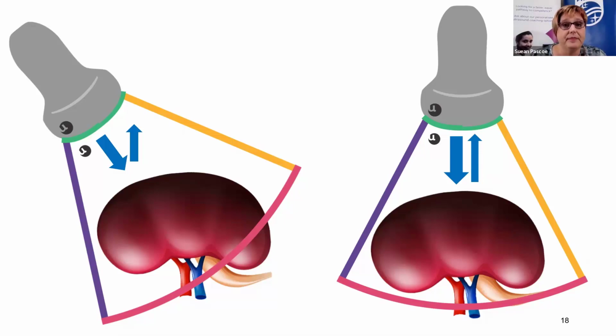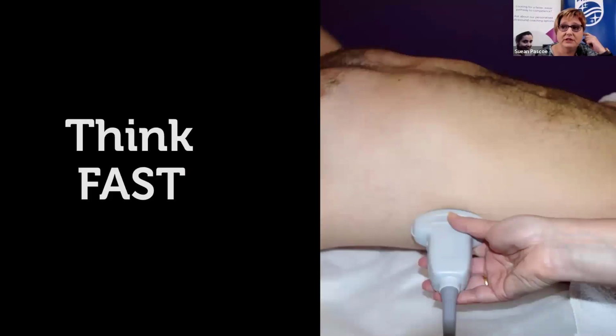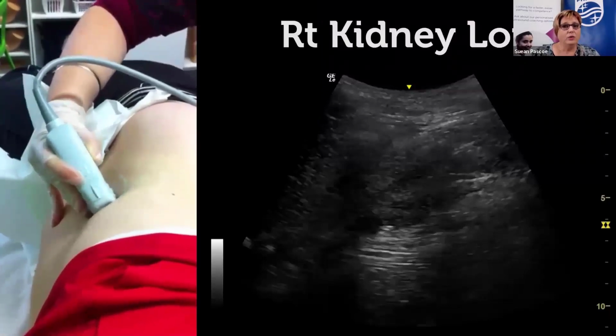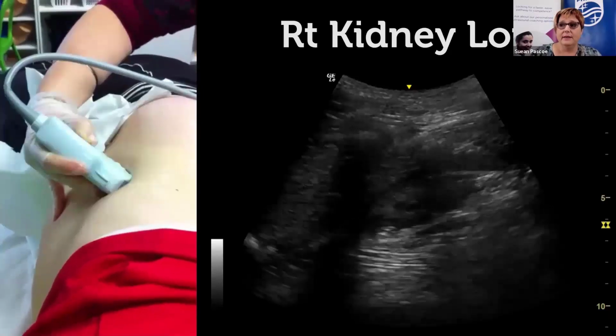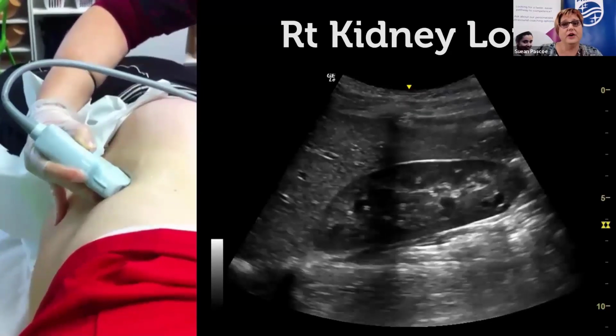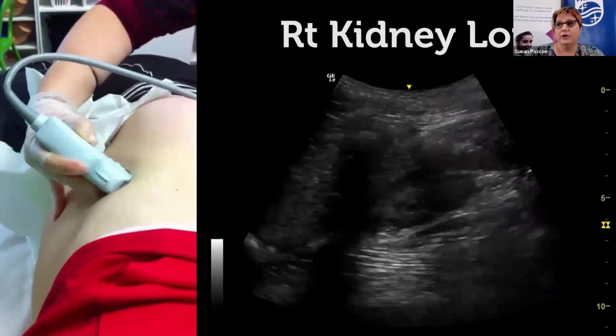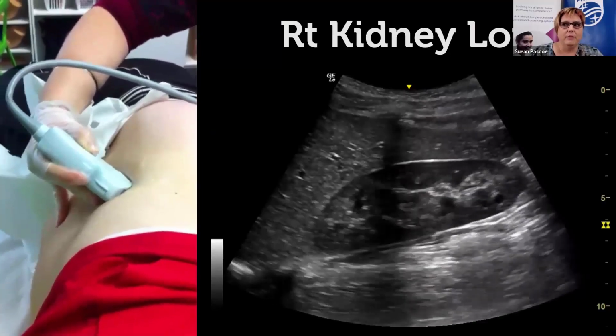Now, when your patient's in the supine position, think about the FAST exam and how you'd scan the FAST exam. Bring your hand position down so that you get out of your own way and you can perform a thorough examination. So come around and look as if you were looking for the right upper quadrant window. As I said, I have a very, very low threshold for rolling these patients on their side, because you do get better access. You can get an anterior window laterally from that mid-axillary line, and you can also scan posteriorly, all from that same patient position.